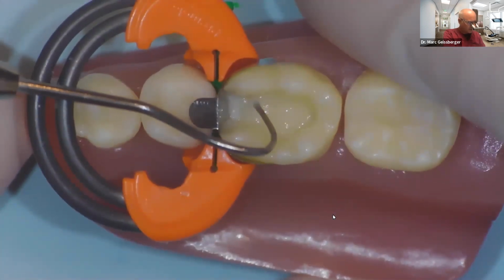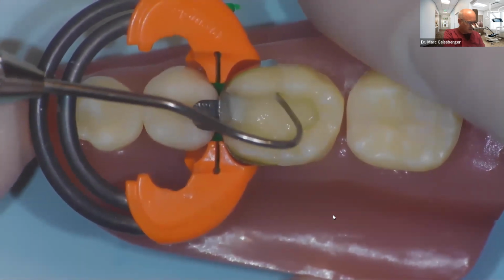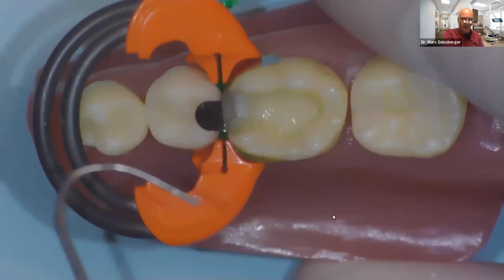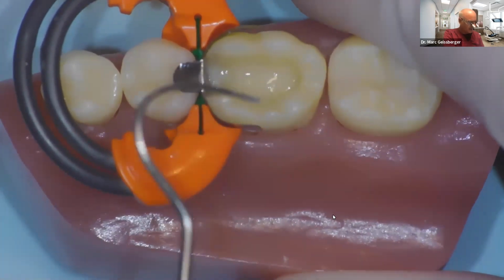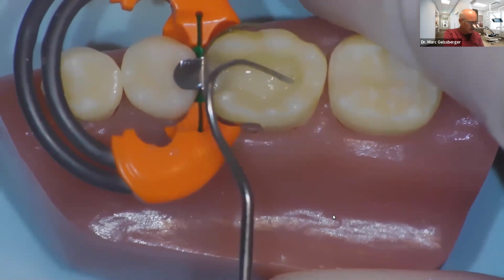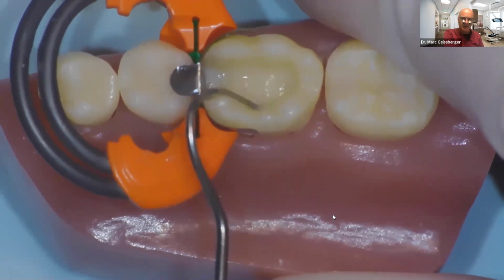And when you do this, you want to make sure that really everything underneath is fairly smooth. So that explorer tip and that warm flowable work so nicely. And you can see how well that's adapted. Now, I want to point out one thing. See on the distal right here, I'm a little irregular. If I see that, I just go in and smooth that.